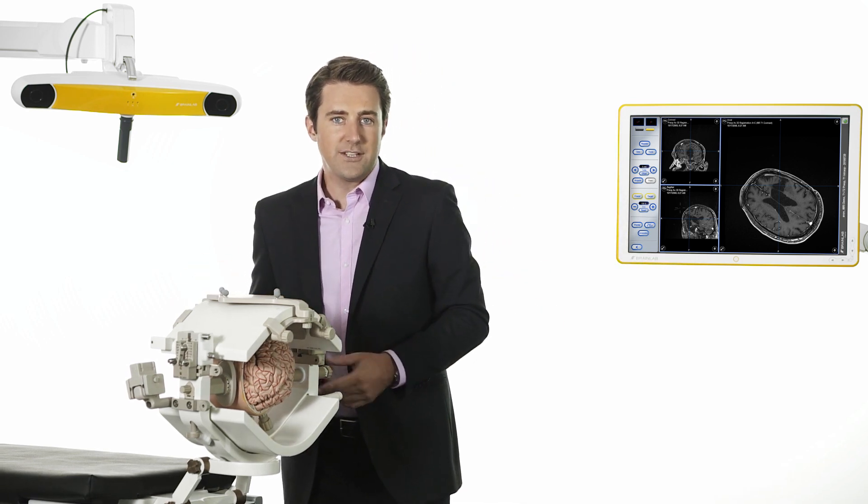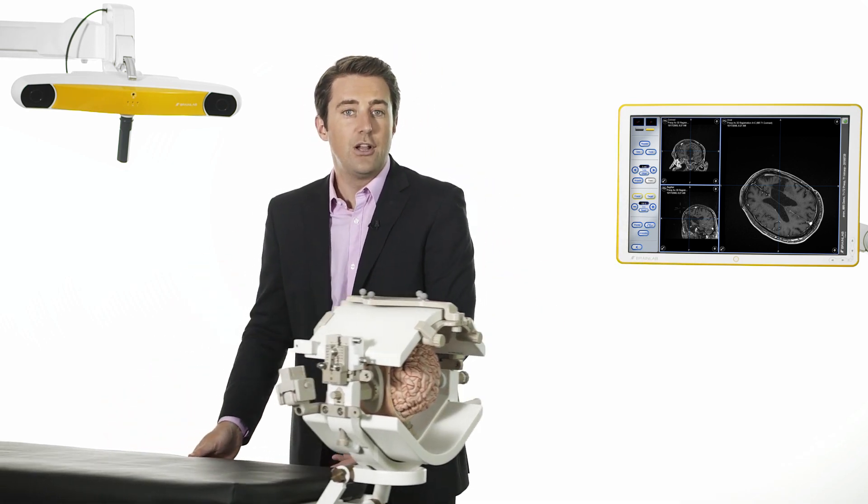Shuttle systems ensure smooth patient transport from the OR table to the scanner.